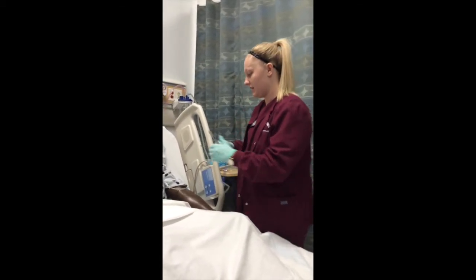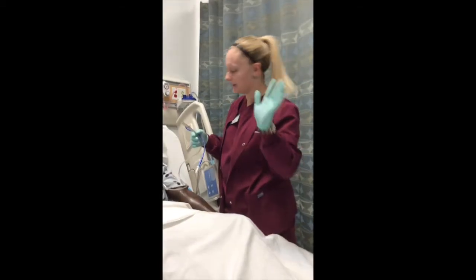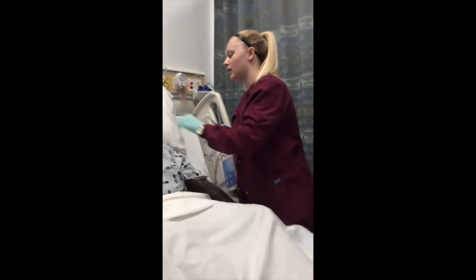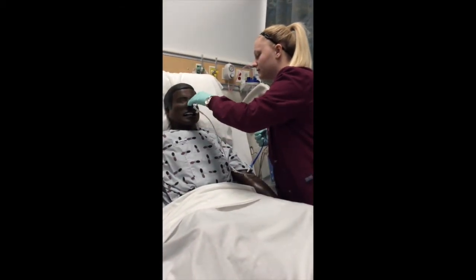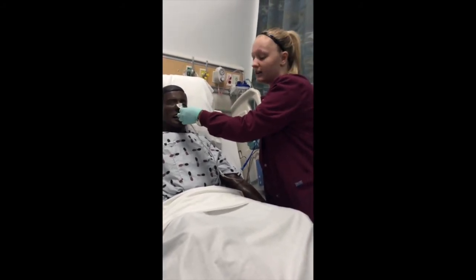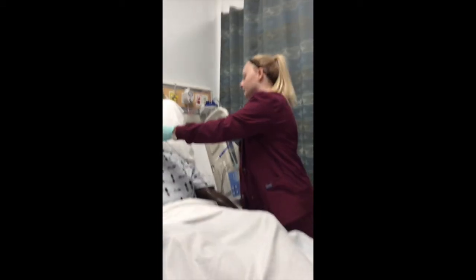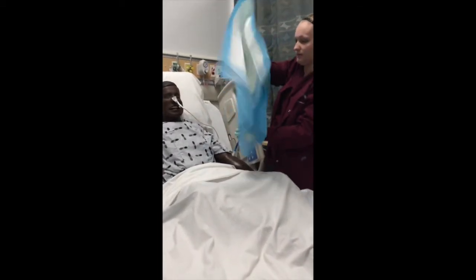I'm going to perform hand hygiene and put these gloves on, which I've already done. Hand hygiene, gloves on, and then I'm going to unhook this. I'm going to have a tissue in their hand, that way they can blow their nose afterwards. Something else I'm going to want to have is their chux pad underneath them.